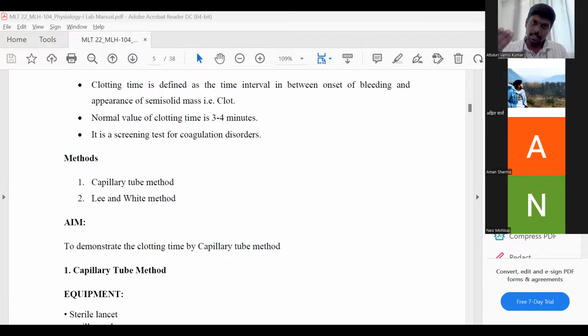As you stated, temperature will affect the clotting time. So why not eliminate such an issue? Why should we do this clotting time at room temperature? Maybe at room temperature it is somewhat lower, so it will clot quickly, and that may misguide us. That will give us false positive or false negative results, like the patient has no issues. That's why we need to cross compare this in the water bath. That will give better results.